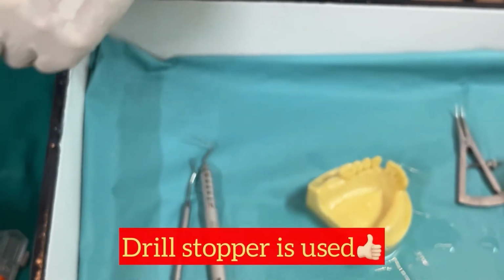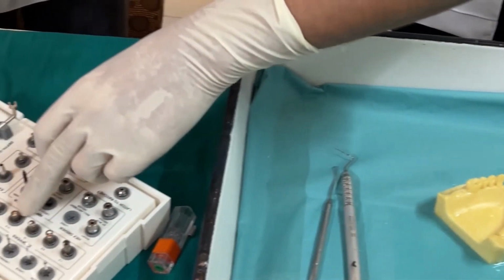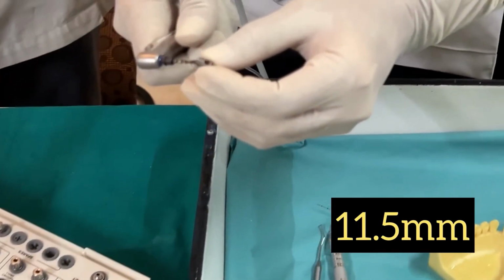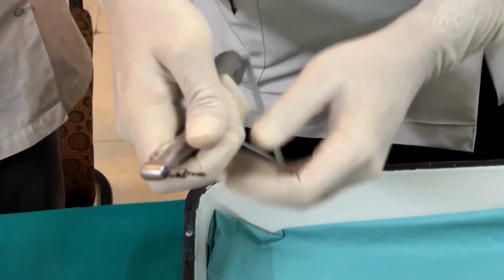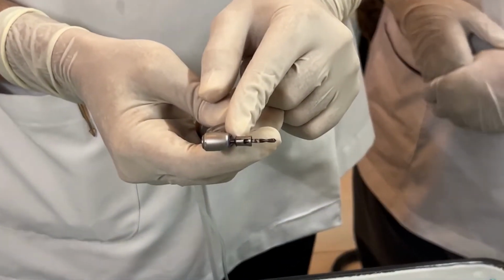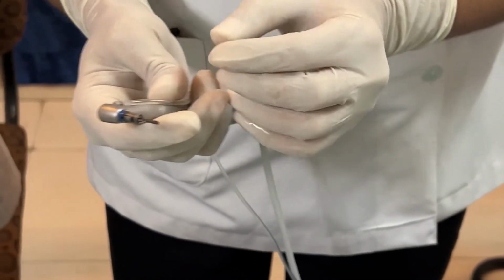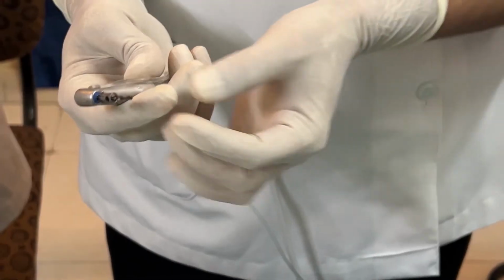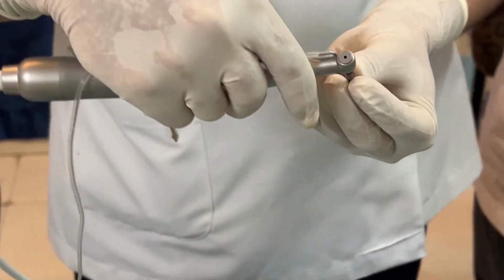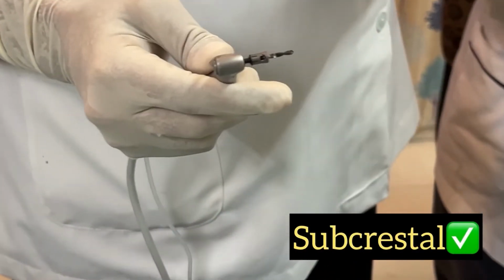Once I have placed this, I need to apply a stopper according to my 11.5 millimeter implant. So I'll be picking up the drill stopper of 11.5 millimeter, and now I am placing that stopper in my drill. Now this 11.5 millimeter stopper means what? That the remaining drill which is outside this stopper is slightly over 11.5. The tip is not included. So if I were to go full length with this drill, my ultimate implant would be subcrestal only. Are you getting a point?